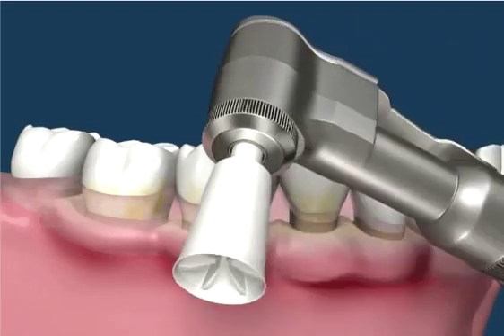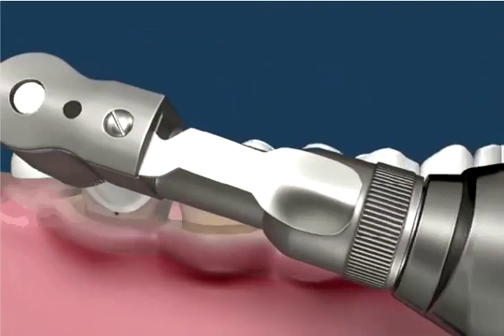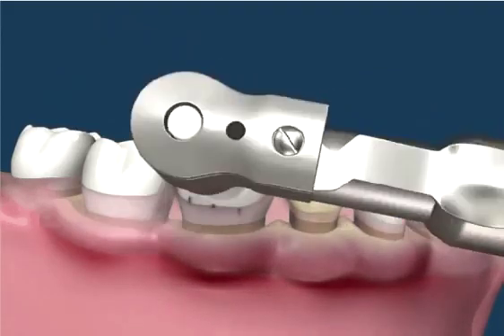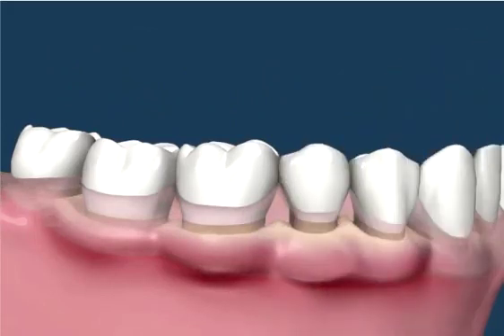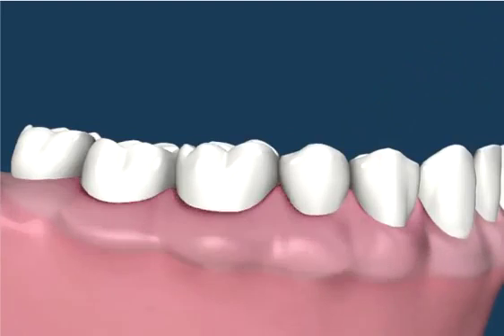Finally, the teeth can be polished with a rubber cup and an abrasive paste to remove debris and stains from above and below the gums. With the calculus gone, the irritating factors will have been removed and the tissue will get back to health.